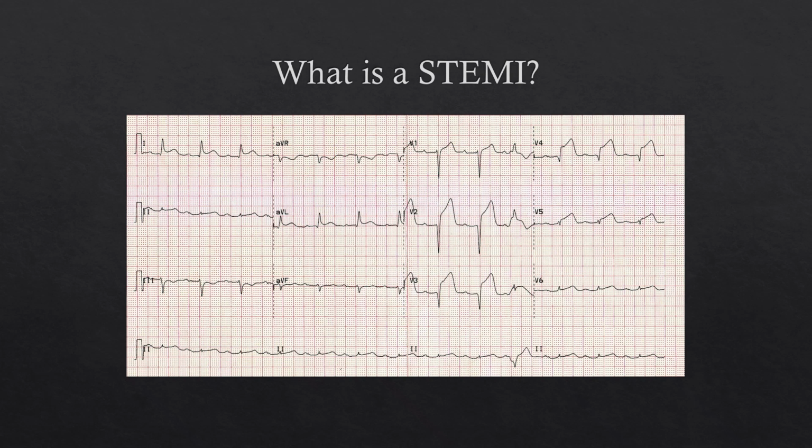So what is a STEMI? When we see ST elevation, what does it mean pathologically? What's going on in the body? I'm hoping if this patient rolled into your ED or you responded in your ambulance and you saw this ECG pattern, you'd be able to recognize that this is an obvious STEMI. But what does that mean when we activate? What do those ECG changes represent? We're going to talk a little bit about that because as we start differentiating our traditional STEMI criteria from your OMI criteria, and what an OMI is and why it's important, it's imperative that we understand that underlying physiology and how we can better differentiate these patients and get them to where they need to go.